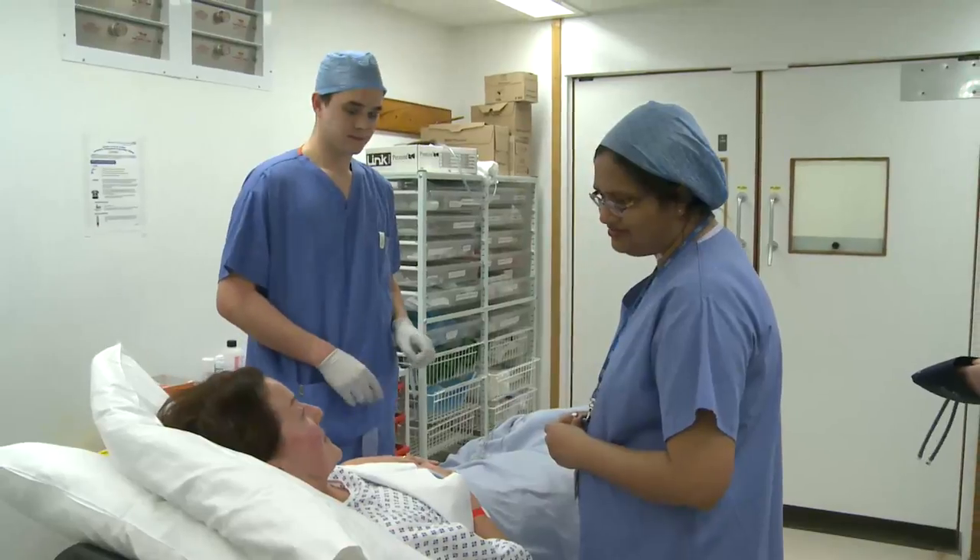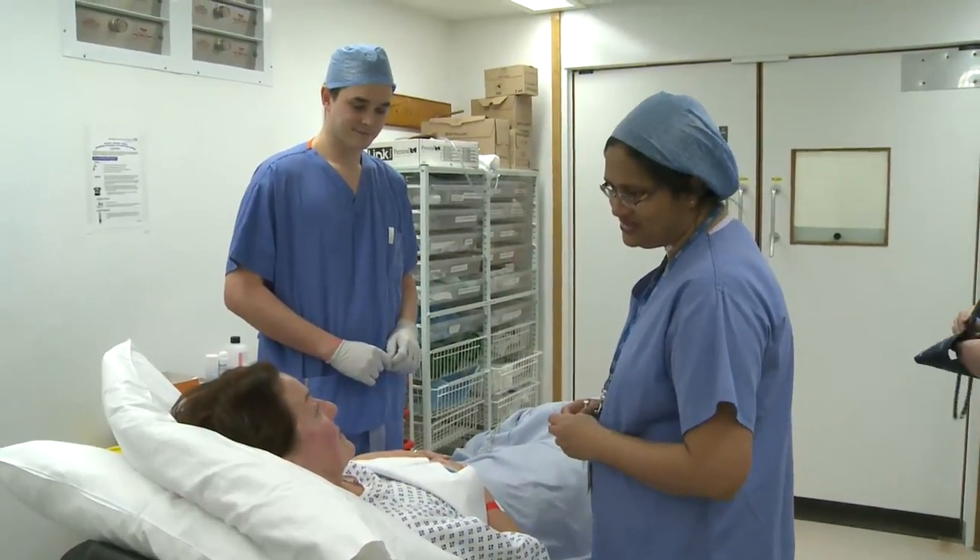It's an operation under anaesthetic, normally general anaesthetic, to look inside the knee with a small camera and do operative work with small instruments. It's normally done with two or three keyholes — normally two just in front, either side of the patellar tendon just below the kneecap — two small incisions normally under a centimetre, and the camera is popped in through one.